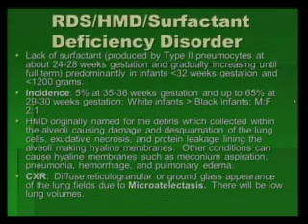In transient tachypnea of the newborn, the lung volumes are normal to increased. In meconium aspiration, they're hyperinflated. In RDS, surfactant deficiency disorder, they are low.